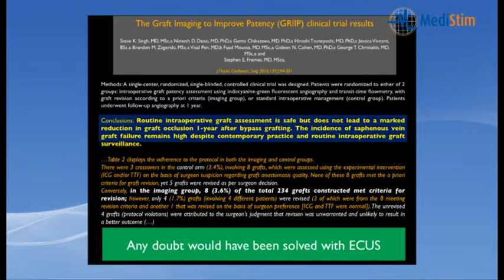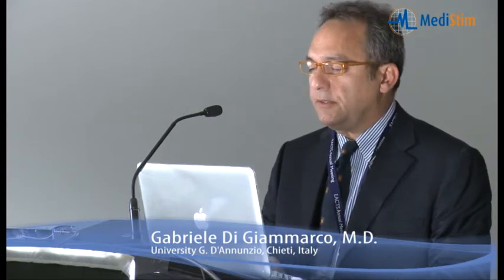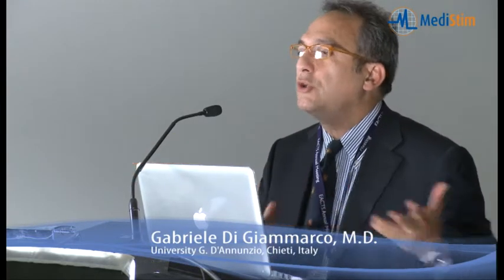The conclusion is that routine intraoperative graft assessment is safe, but does not lead to a marked reduction in graft occlusion 1 year after bypass grafting. That means it's not useful at all, so you can do without it.